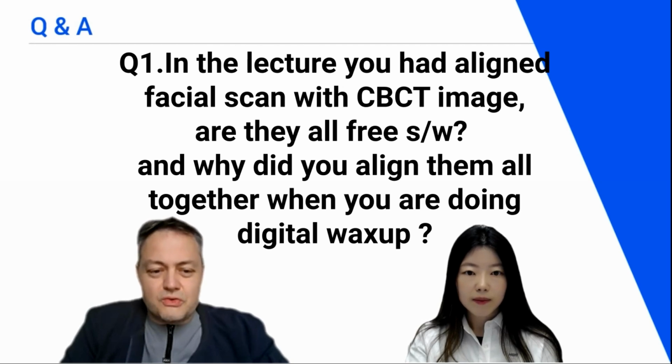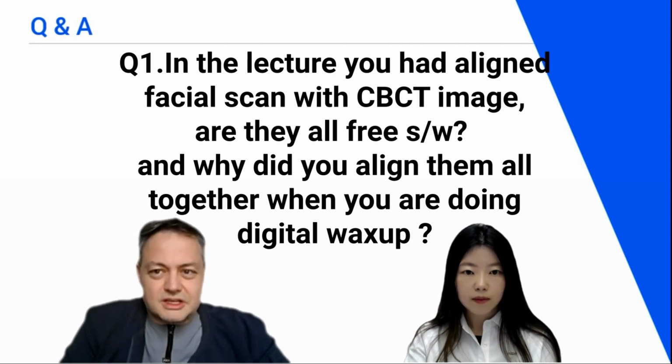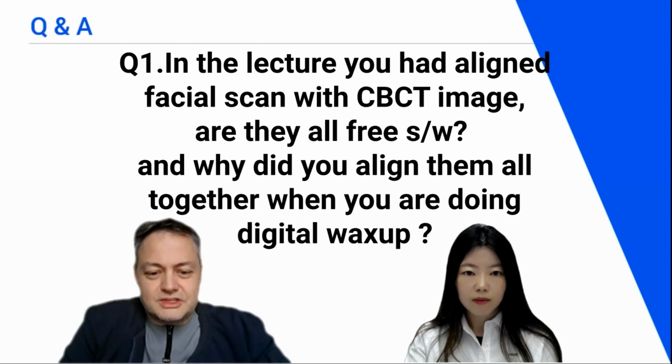And then you can go forward and buy maybe hobbyistic object scanners, or maybe even scanners like the one from Funk that I'm using, or maybe the one from Ray, that actually give much better face scans. And with this data, you can actually build better smile design for the patient, because you can put the teeth on a position that is actually beneficial for the smile of this patient.